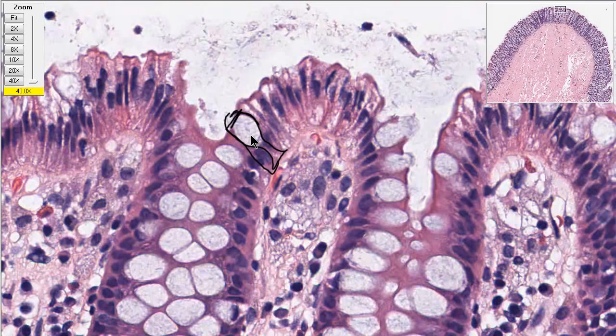It'd just be bad branding if they called it mucus in a bag. Yeah, exactly. So they stick with goo. We'll call it that, but this one has lots of sugars and takes on a lot of water, and that's mucin.